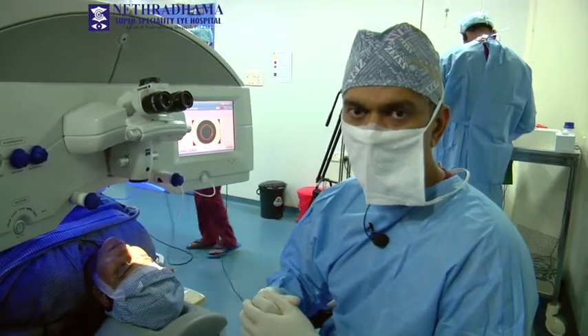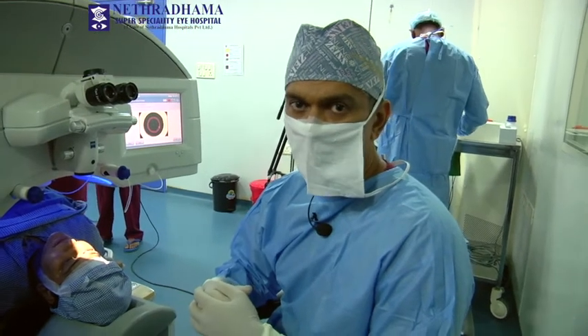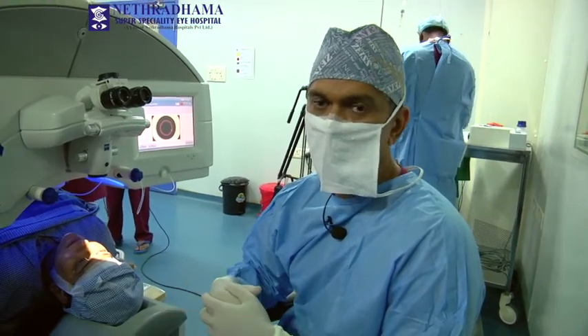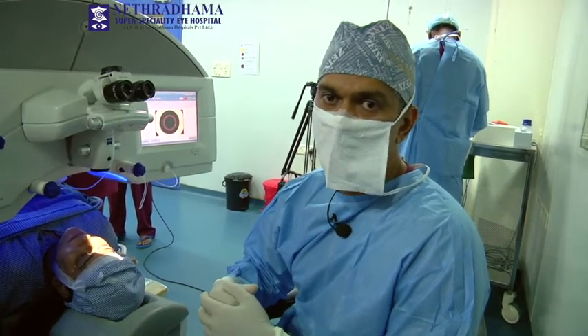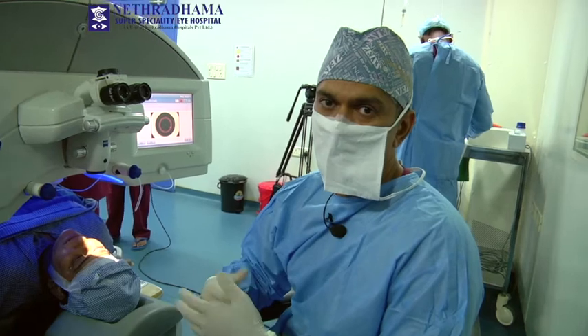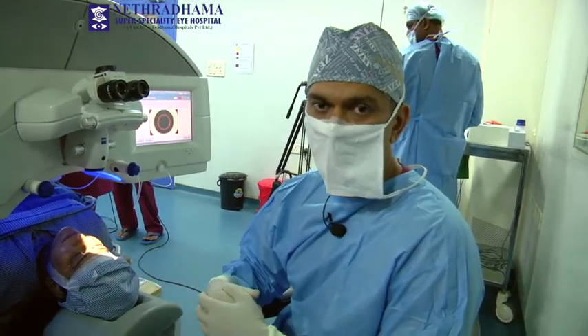That was a demonstration of the Kera rings with the Visumax femtosecond laser for making the channels. It is quite a simple procedure and it improves the regularity of the cornea, improves best corrected vision, and then the residual refraction can be corrected with the toric ICL. Thank you.